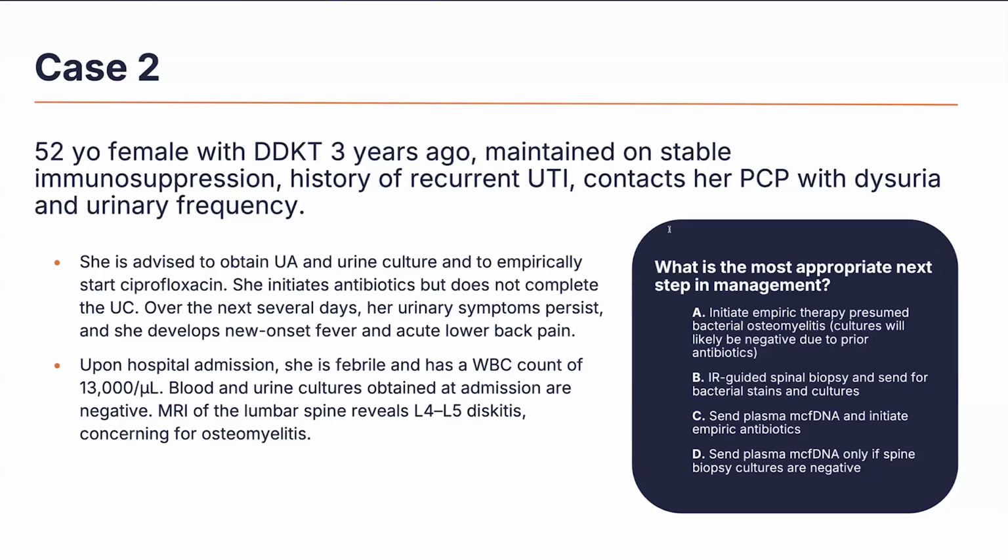And after the polling, we have managed to sway many people to sending Karius early on as the frontline test. Now, this is an area where I really wanted to highlight that Karius and CMT are not exclusive, where you have to choose between one or the other test. They both have their strengths.